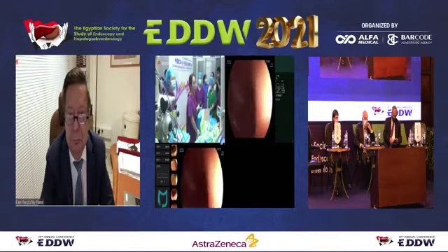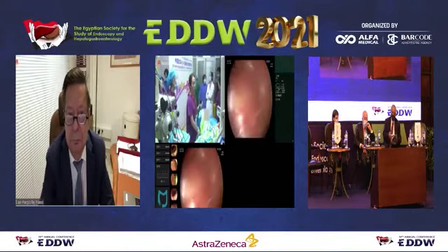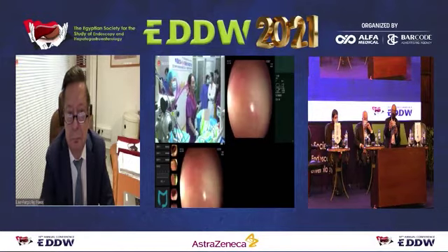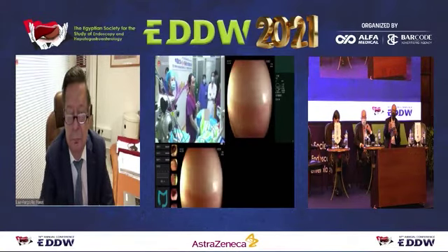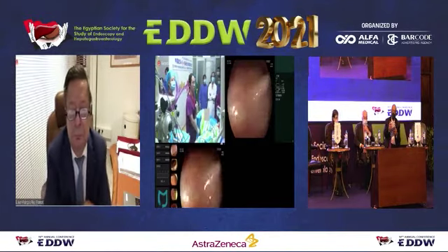It depends on the patient's condition before the examination. For young people with no suspected malignant disease, we commonly use white light.